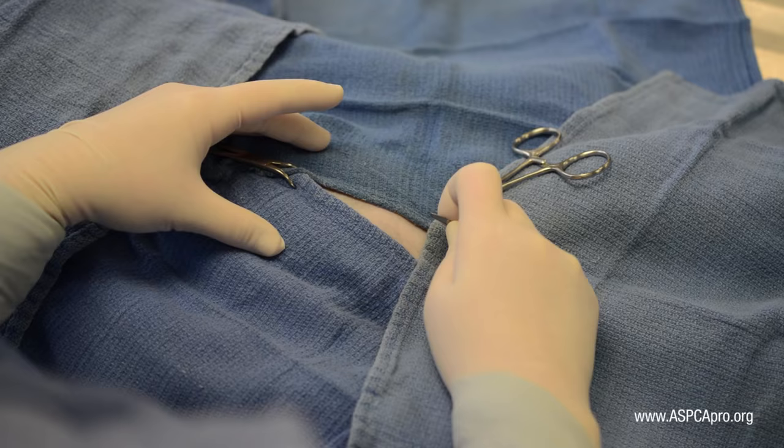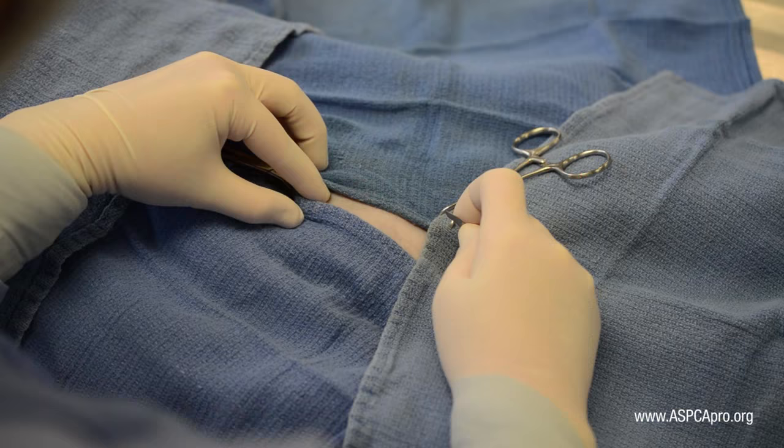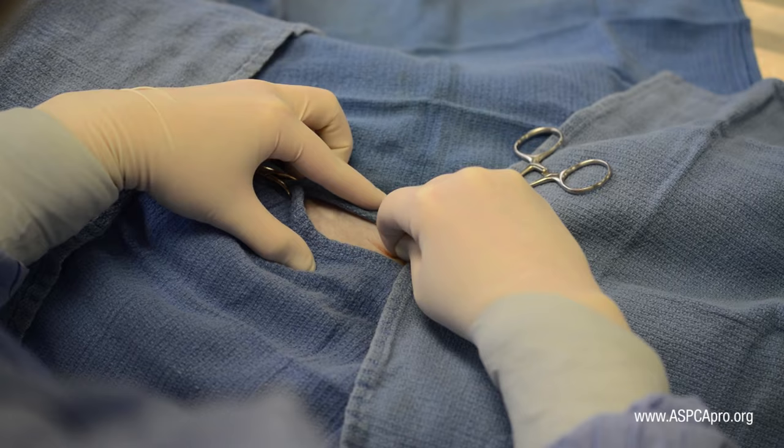Palpate the cranial edge of the pubis with the pinky or ring finger of the hand holding the scalpel blade. The ring finger of the other hand rests lightly over the umbilicus. The incision is then placed at the midpoint between these two anatomical landmarks.